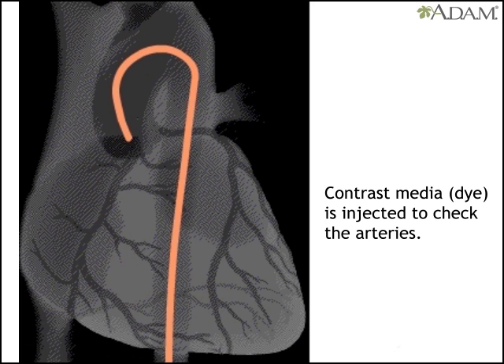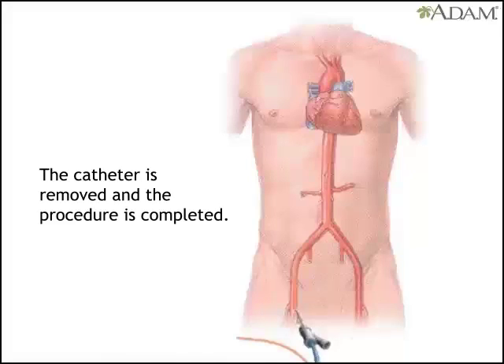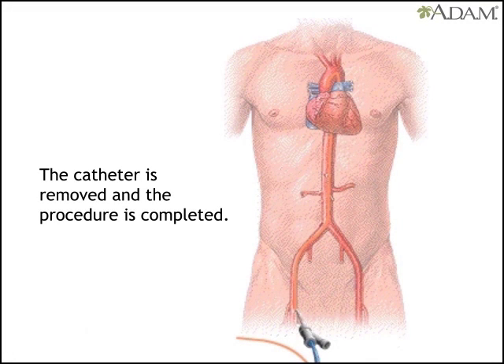Once the compression is done, dye is injected and an x-ray is taken to check for changes in the arteries. Then the catheter is removed and the procedure is complete.